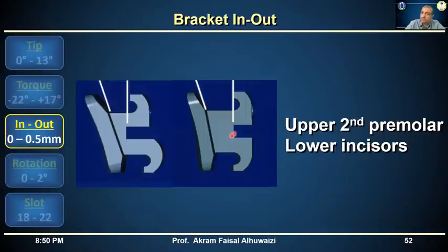But for the upper second premolars, I generally don't like the MBT ones because they break off so often. I'd rather use the upper first premolars or the upper second molars of the Roth system, which are not the thick ones, the thin ones, because they break. But they do a good job of pushing the 5 lingually, but I generally don't like them.